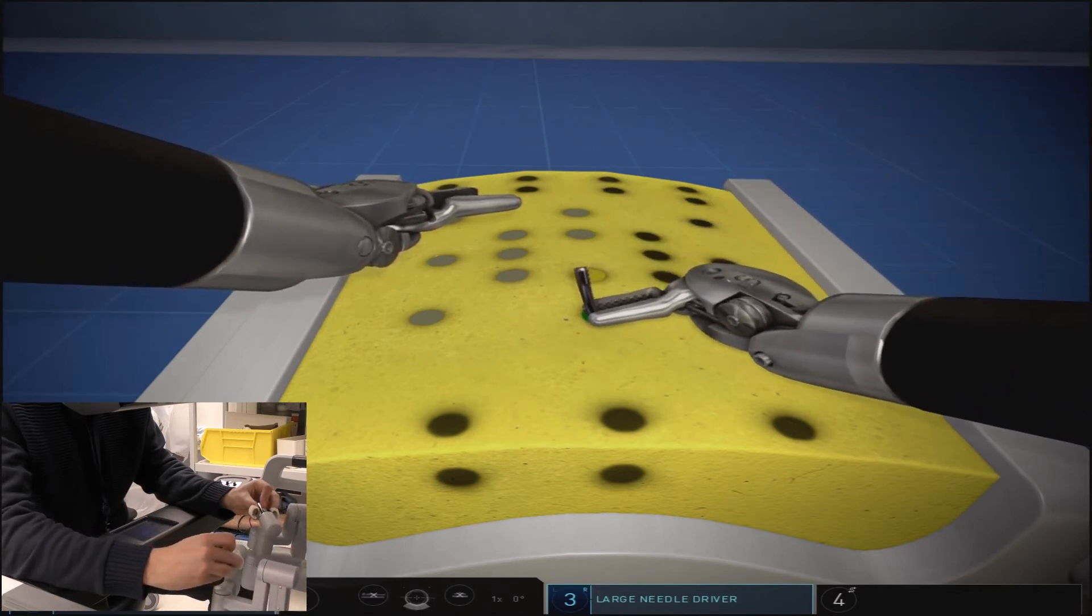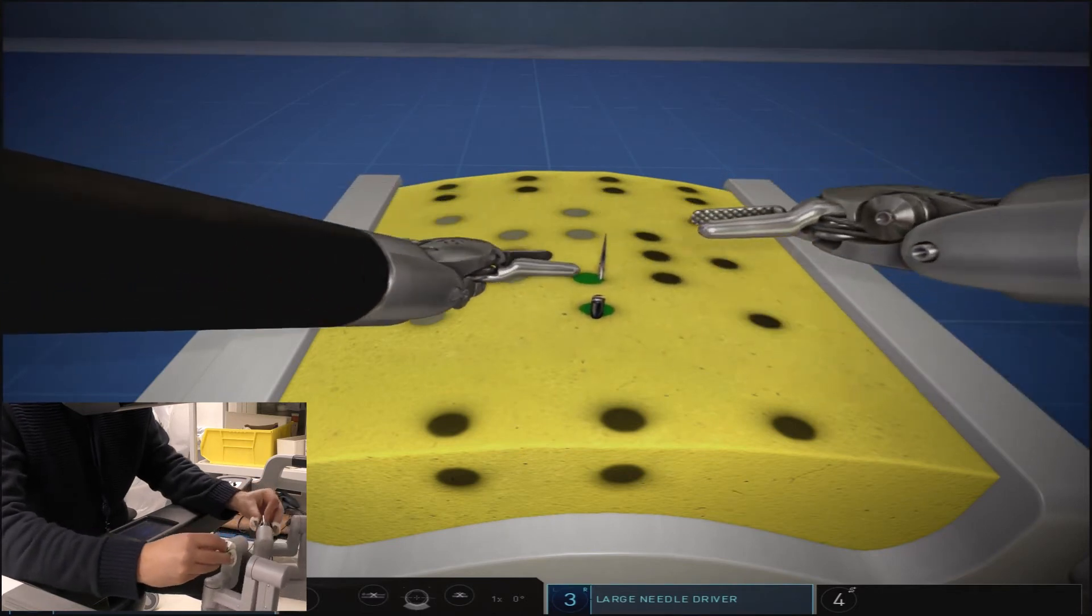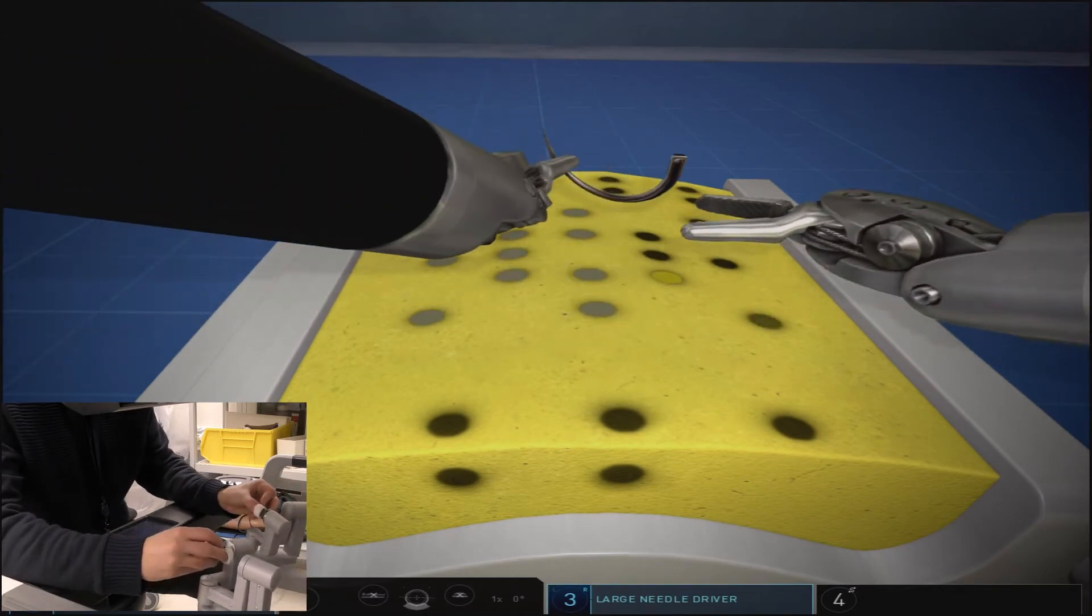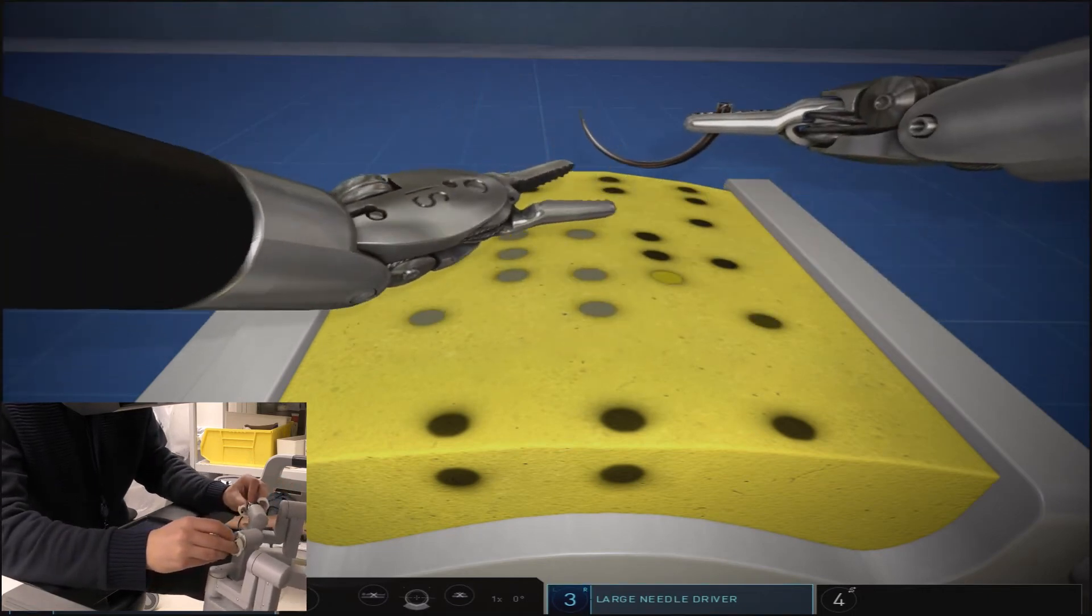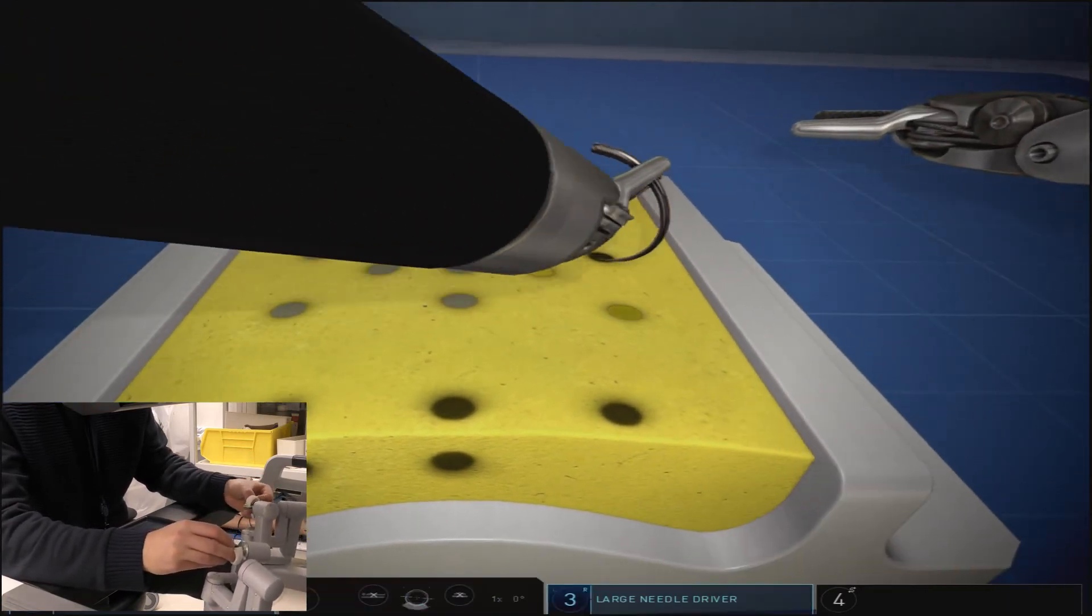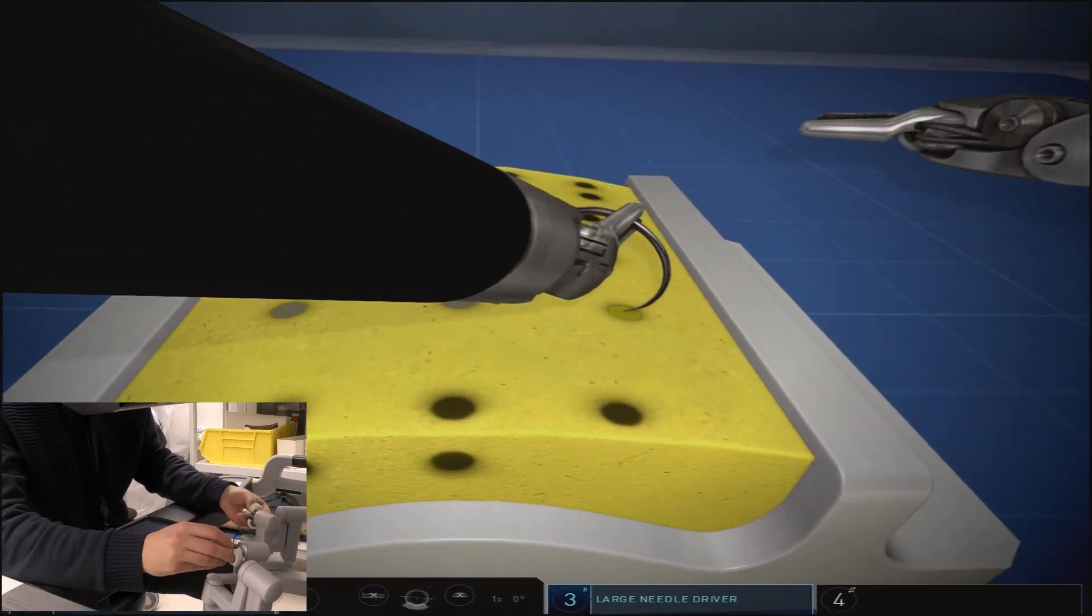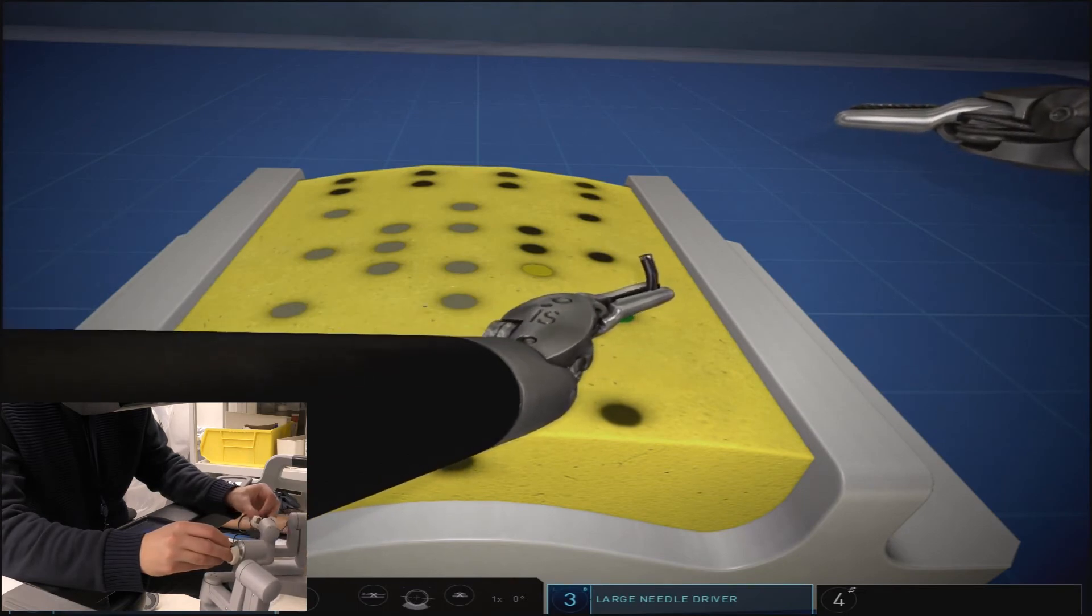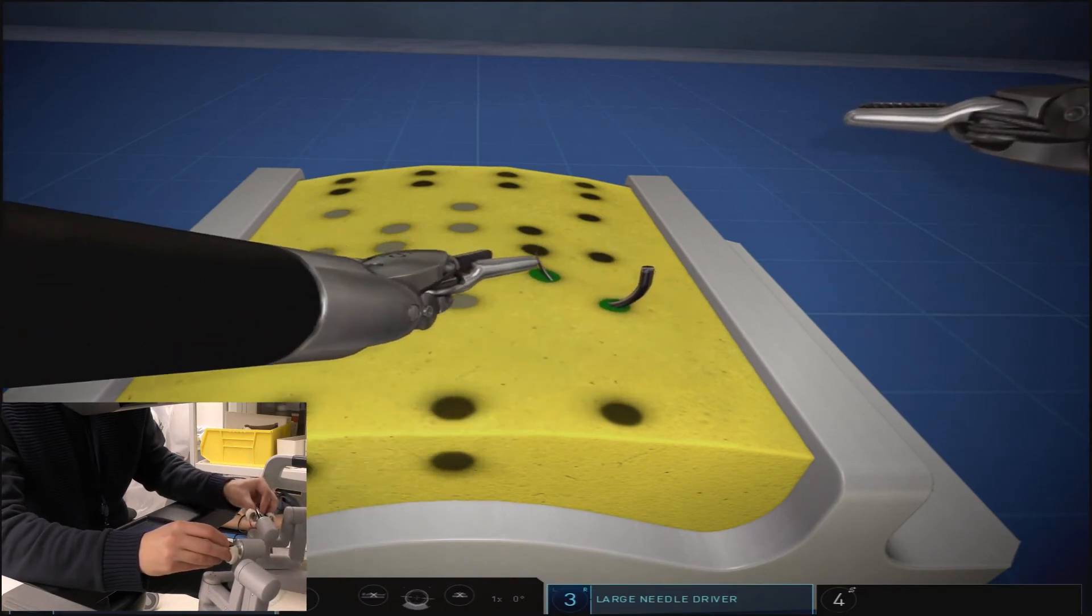You see on this pull through here we are anticipating having to use the left arm to perform the next throw, and so therefore we are setting up our needle in the correct position as well as grabbing the needle in the pronated position with the left hand in order to make an easy successful throw.